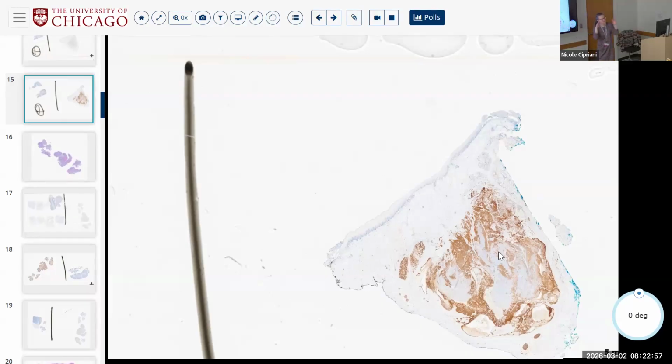They don't have to have a perfectly rounded border. They can have these pseudopodia-like projections into the nearby tissue and still be benign, but those things might be an indicator of recurrence. Whether or not they have little pseudopods or little satellite lesions that might not come out in the primary excision, they can be left behind, and then they regrow.